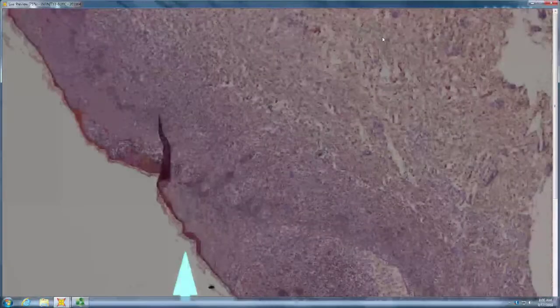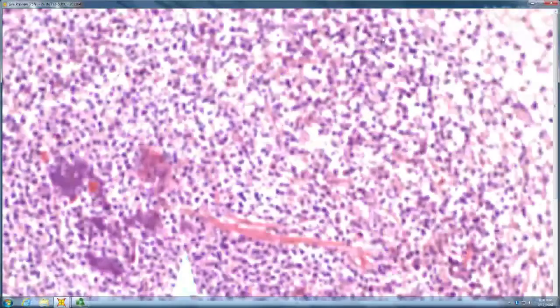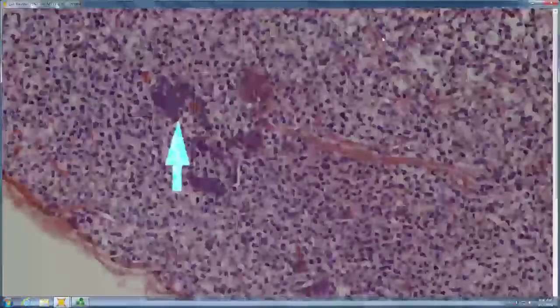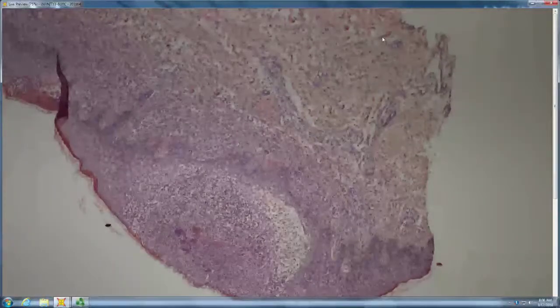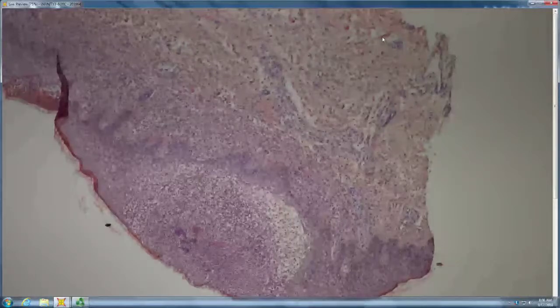Looks like you've got a lot of spongiosis with a collection of, I think it's a mixed infiltrate, but maybe neutrophils in there. Lots of neutrophils in there. So infectious versus, and you look to see, is that bacterial colonies? But it's not really, it's just kind of smudge there. So this is someone with psoriasis with an edematous face and lots of pustules. Maybe AGEP, except that he's not on any new antibiotic, and this happens like four times a year, every time he gets a cold.